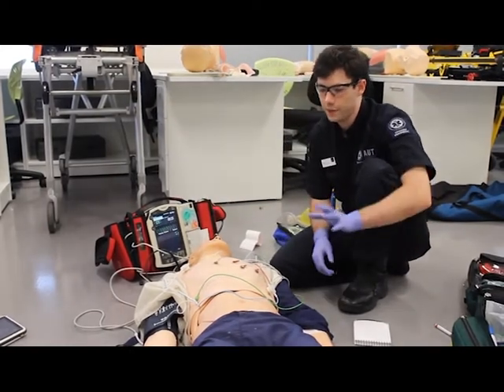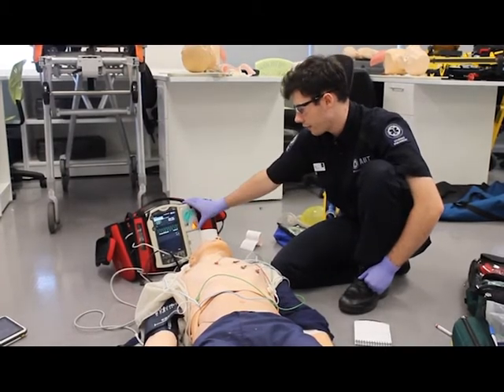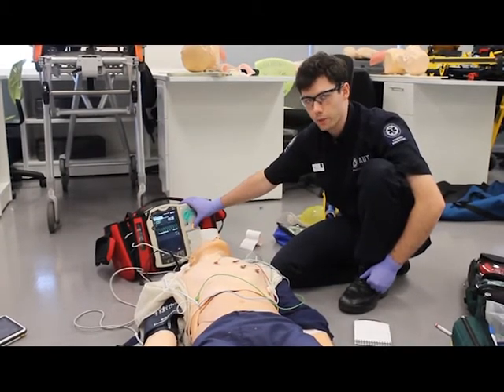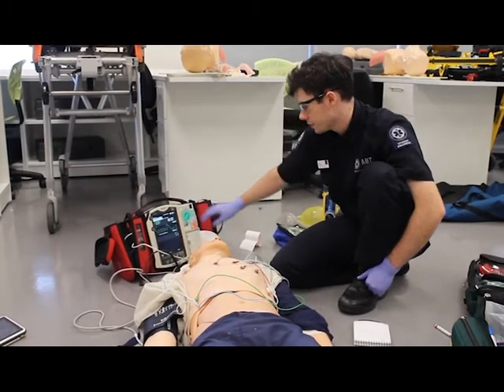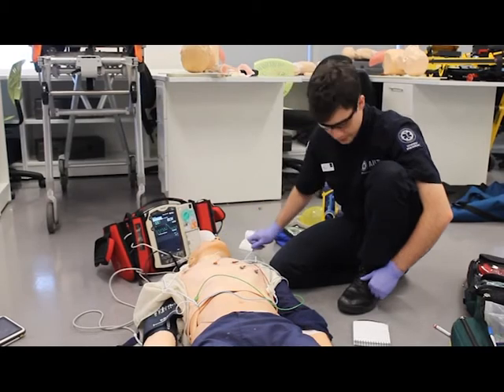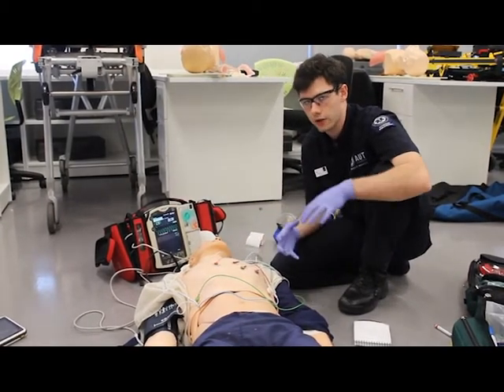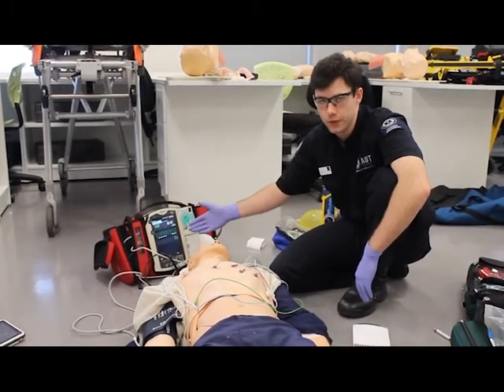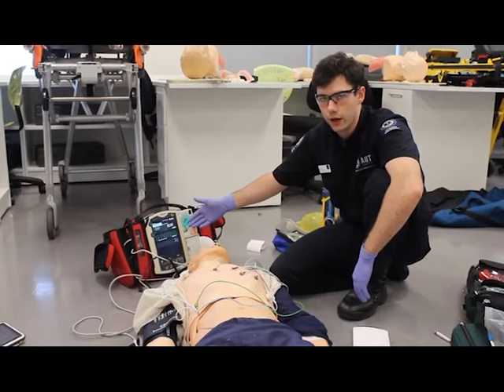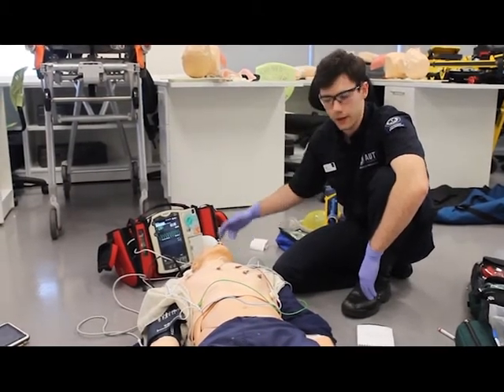Alright, everybody stand back. I'm going to shock the patient in a moment. Now that I've charged my defibrillator, I'm going to press and hold the shock button to deliver a shock. Shock's been delivered. Now I'm going to reassess the patient. I'm going to go back and do my ABCs again and reassess his rhythm. Unfortunately, Bob hasn't been reverted, but in this case I can re-cardiovert him again.